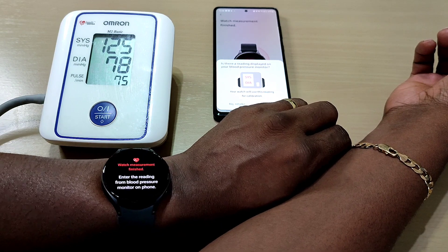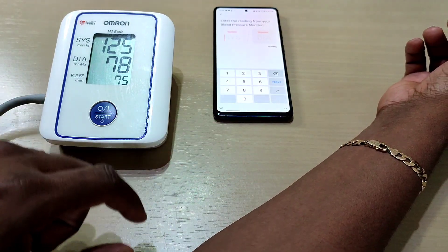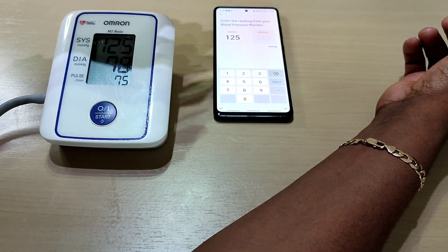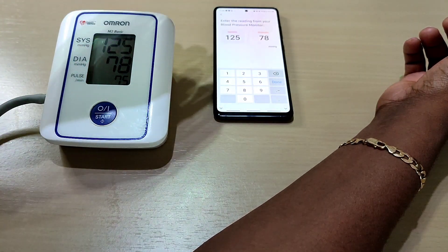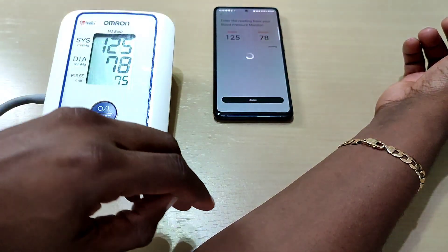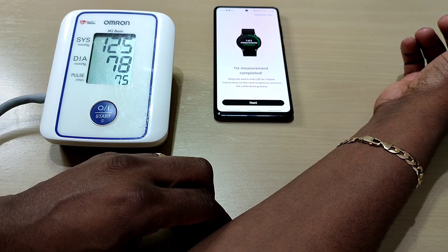All right, so that's our first reading. The first measurement is complete — we've got to do this another two times.